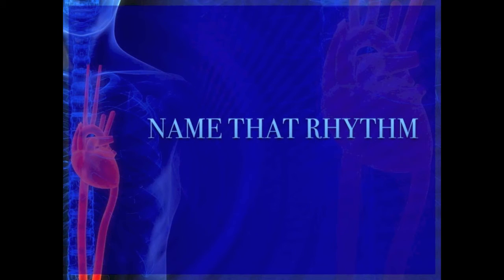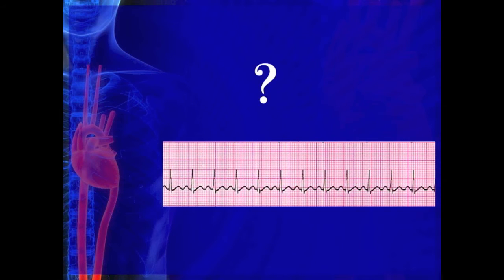We are now going to play a game called Name That Rhythm. What rhythm is shown here? This rhythm could present in a patient as seen in the following footage.